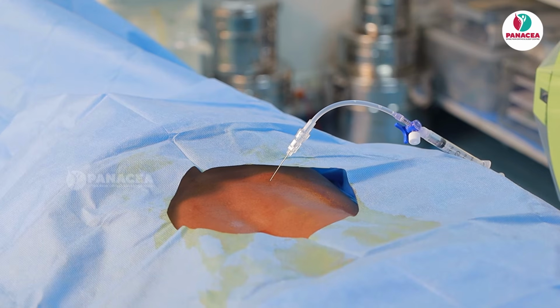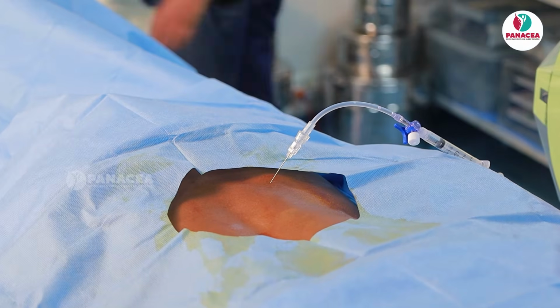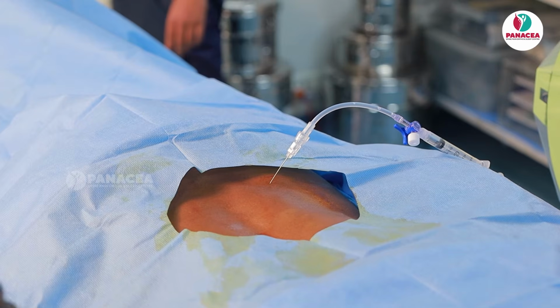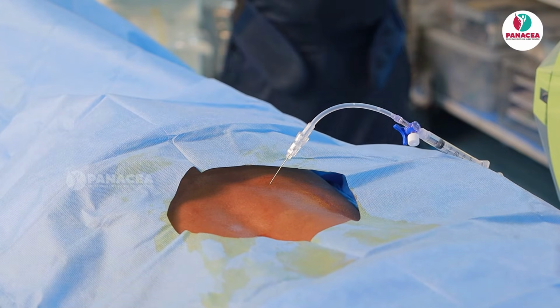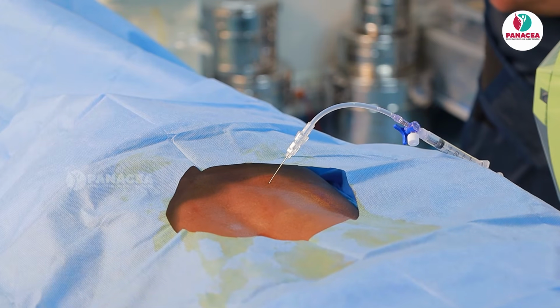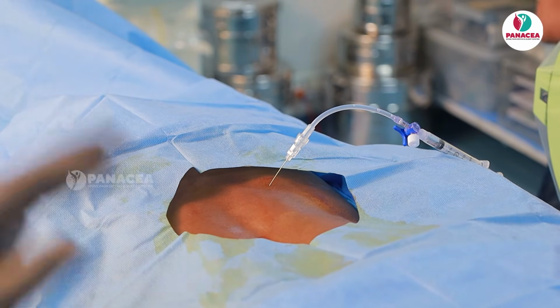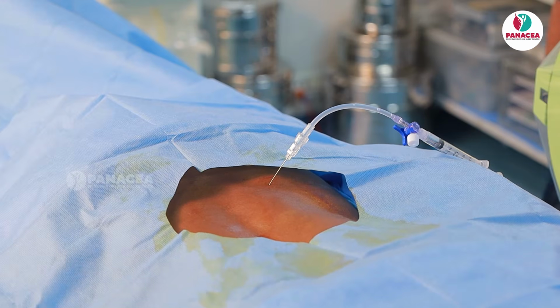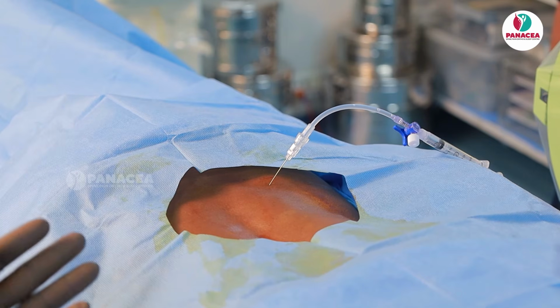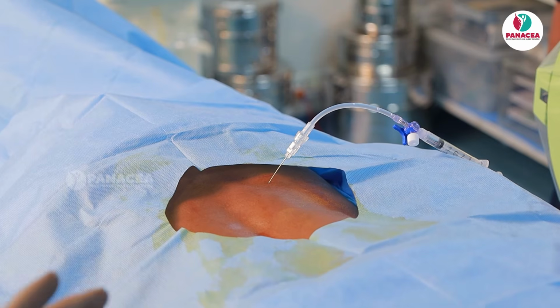And second point is, people ask me, can we do it in real-time fluoroscopy? I don't advocate doing it in real-time fluoroscopy. The reason behind is, if you do real-time fluoro, you will end up with too much radiation. So I advocate giving 0.2 ml, wait for 8 to 10 seconds and take a shot. Meanwhile, if the dye is intravascular, it will disappear. If it is intrathecal, it gets diluted. If it is exactly in the epidural space, it will stay like that even after 6 seconds or 10 seconds or 20 seconds. So wait for some time and take a shot, so you end up with less radiation.